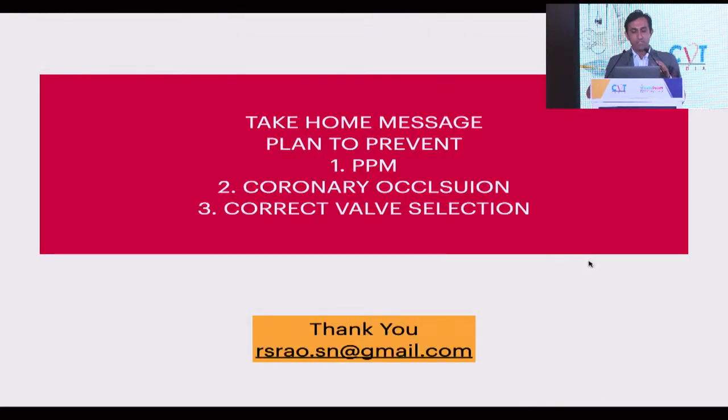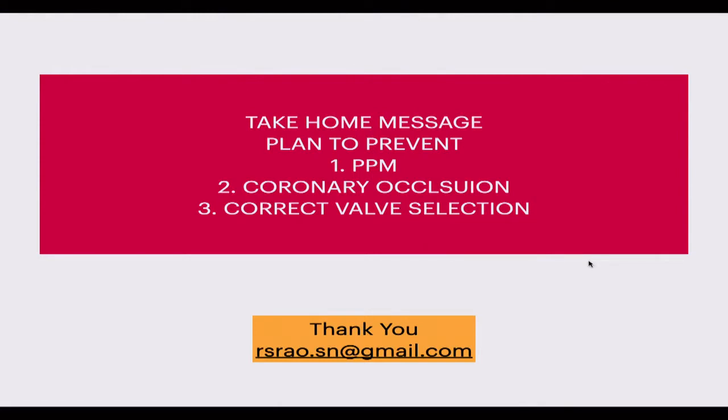So, take home message for a valve-in-valve procedure, very important. We need to plan to prevent three things: patient-prosthesis mismatch, coronary occlusion, and the correct valve selection. Thank you very much for the kind attention.